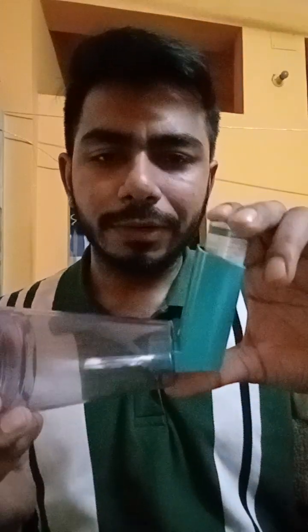Then seal the lips around this mouthpiece and deliver the medication. Then take the medicine thoroughly with a deep inspiration, hold your breath for 10 seconds, and then you can exhale it out, right? So this was the right manner of taking the metered dose inhaler, and a metered dose inhaler should be taken with the spacer.